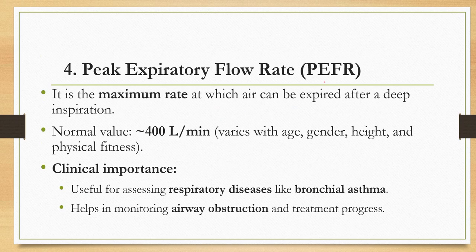Peak expiratory flow rate. It tells us how fast you can blow air out of your lungs. It is the maximum rate at which air can be expired after a deep inspiration. Its normal value is about 400 liters per minute, and varies with age, gender, height, and physical fitness. Clinical importance: it is useful for assessing respiratory disease such as bronchial asthma. It helps in monitoring airway obstruction and treatment progress.